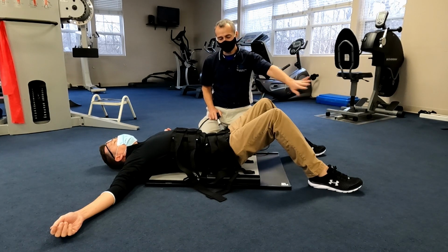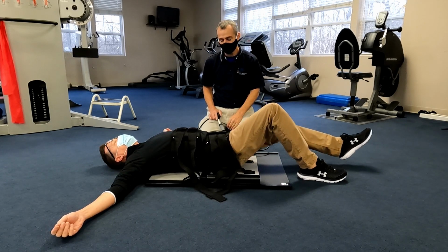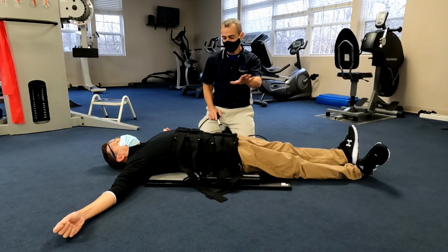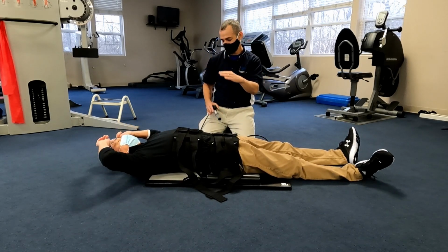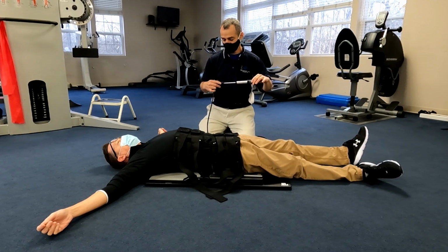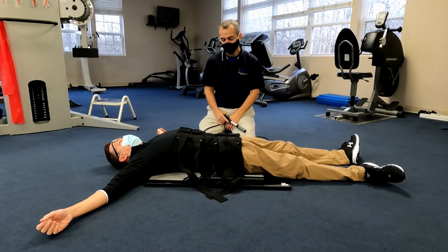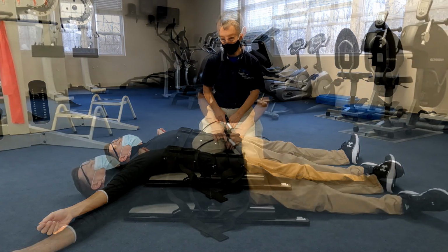And now let's go into the leg straight position. Let's say you feel better with a little bit of extension. So now as soon as you lay your leg straight, that pelvis rolls forward. We get some lumbar extension through there. I'm going to pump this back up a little bit. Anytime you change position, the traction is going to change. So we're back to 20 pounds. Let's do 3 more of the diaphragmatic breaths.